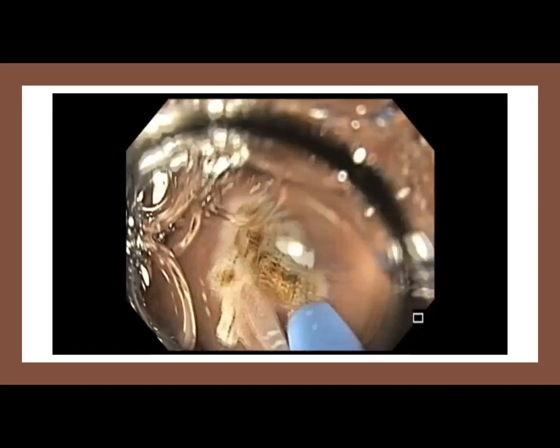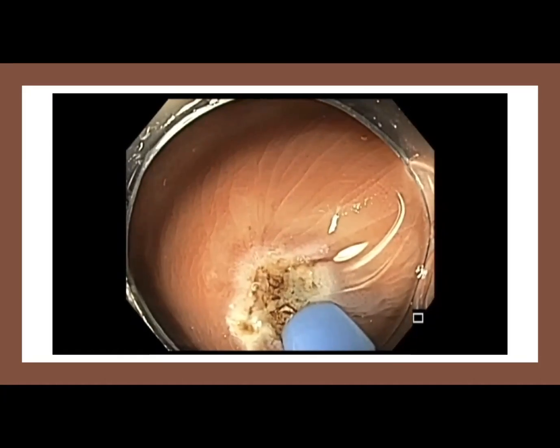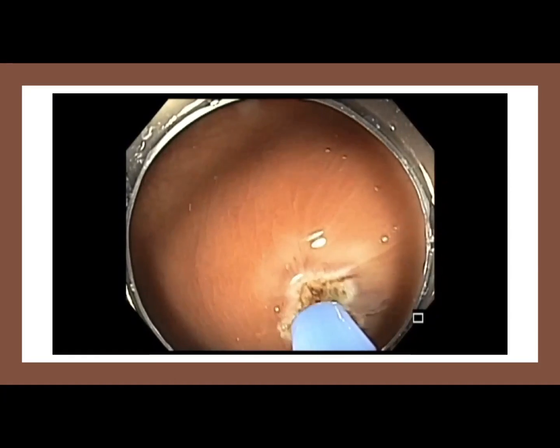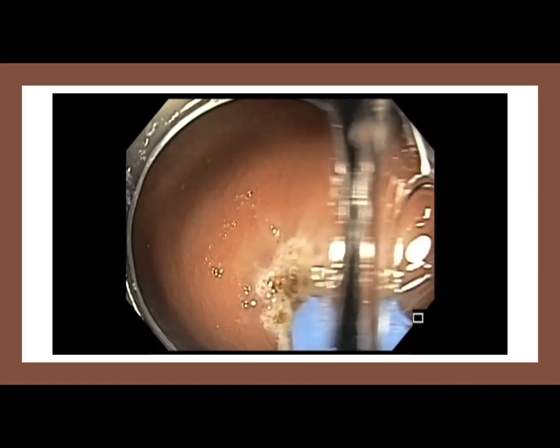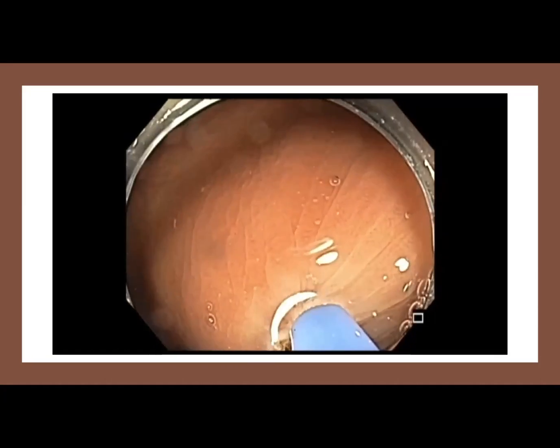And that's why when you take care of a patient with AVM in the cecum, and you want to apply APC, it is a good idea to inject maybe a little bit of dilute epinephrine and then apply the APC to the central feeding vessel. That way you have less damage and you find the feeding vessel.